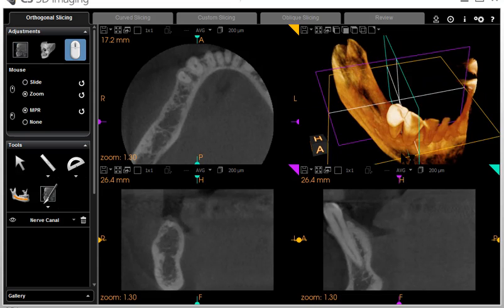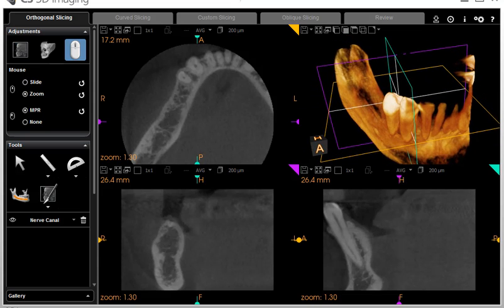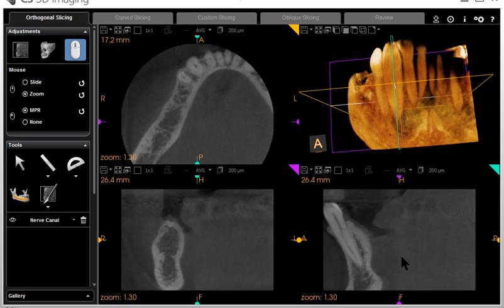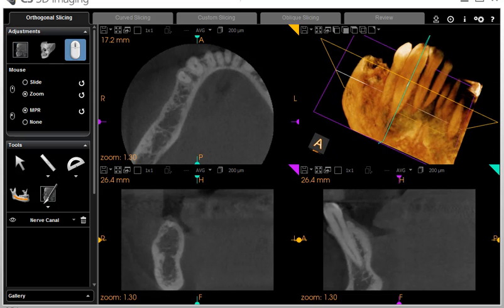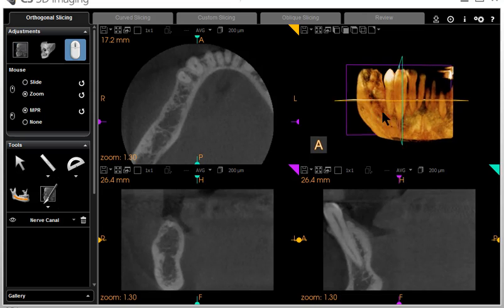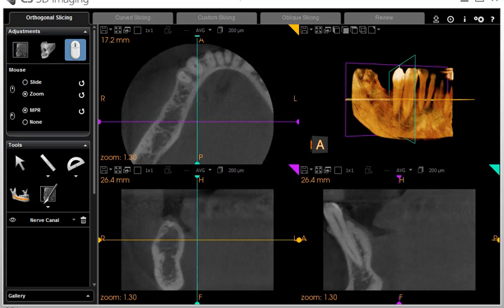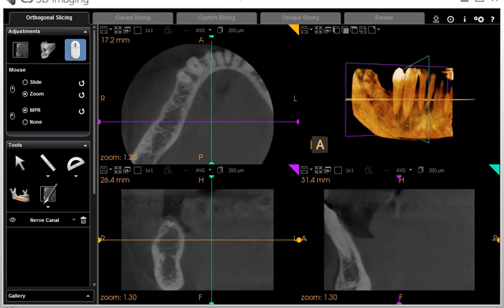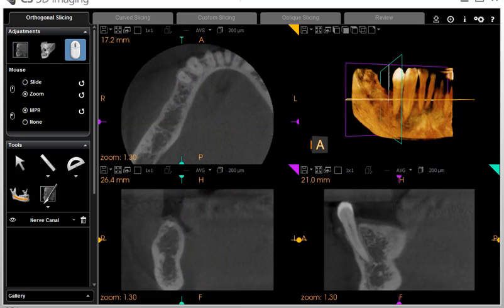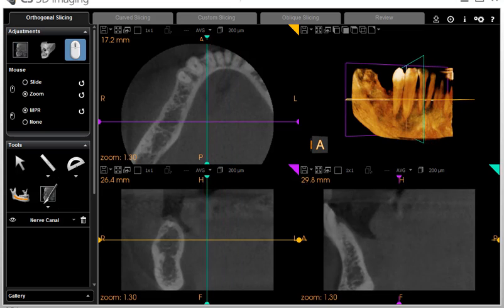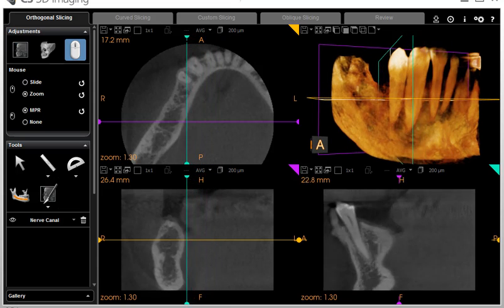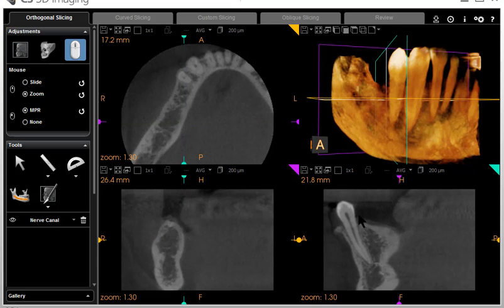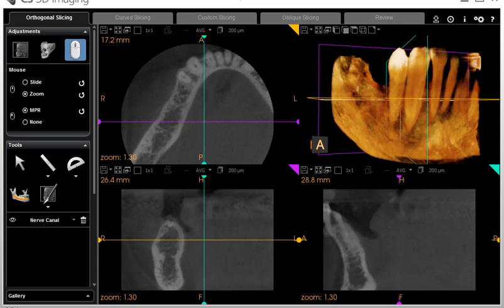Green is the green slice. This shows where in the arch this slice in the lower right is oriented. The axial slice shows you where it is. You can move those slices back and forth in the orthogonal slice by placing the cursor over the semi-circle and holding the left mouse button down. You can see in the upper right how the slice is moved through the scan, and in the lower right you see what that slice is.